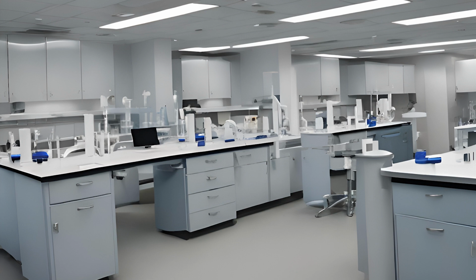But realistically, that's not a best case scenario because it could have been avoided entirely by you asking if they have any allergies and then not using equipment they're allergic to, which is why, because this is under your control, you will never knowingly use equipment that somebody is allergic to. Your patients may experience excessive bleeding if they're taking aspirin or anticoagulant therapy. You have to make sure that pressure is maintained over that site until the bleeding stops. If they bleed for more than 5 minutes, it shouldn't take more than 5 minutes for somebody to stop bleeding when you're applying pressure to the wound. Let your supervisor know.